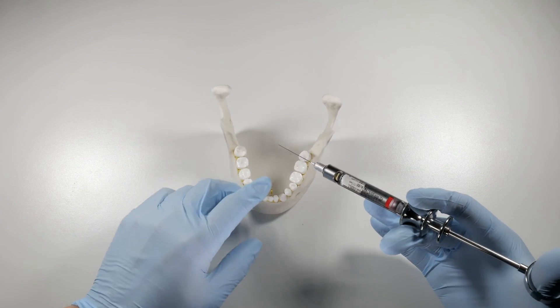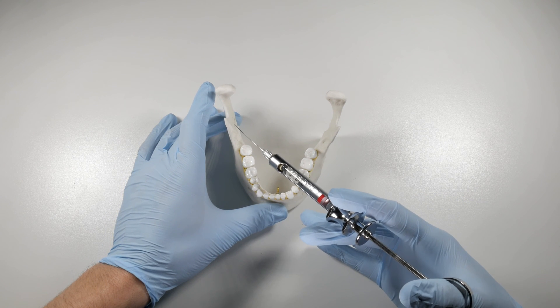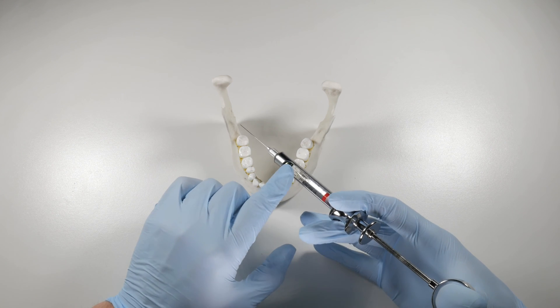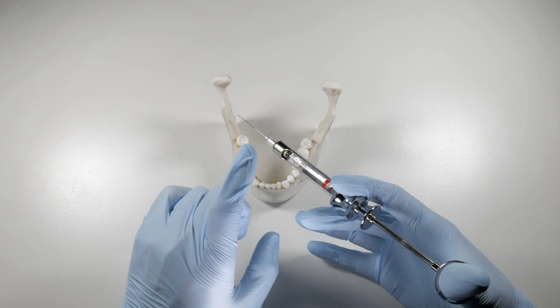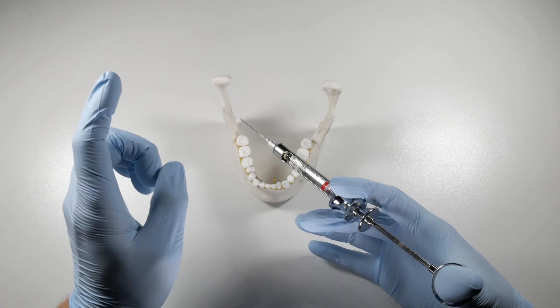What are you going to teach me? I'm going to show you something really interesting that I didn't know. So let's say, for example, we're going to do our lower block — our IAN block. The way that we would normally aspirate is we enter in here, we contact our bone, we pull back on our plunger, and we see if we get any blood entering this carpule. If there's no blood entering this carpule, chances are we're not inside a vessel.